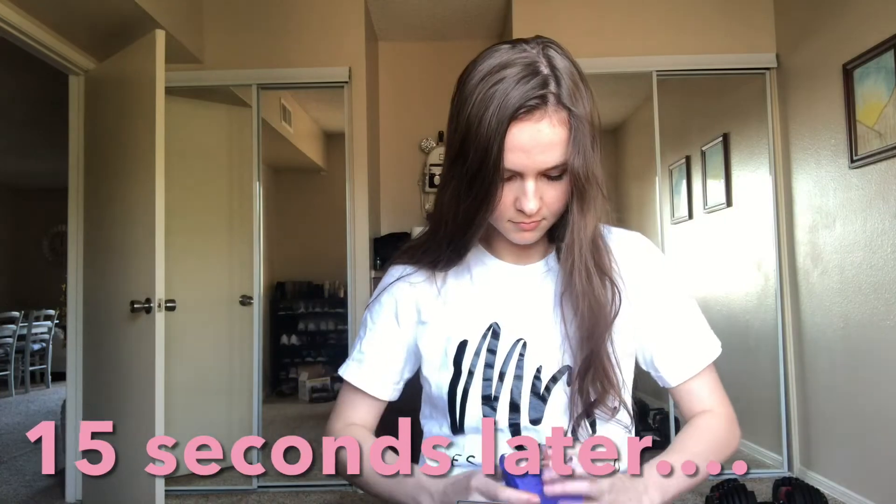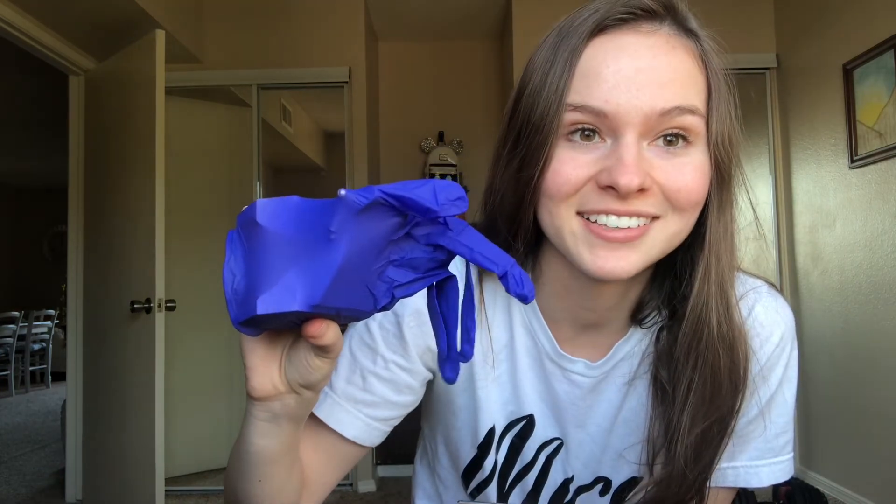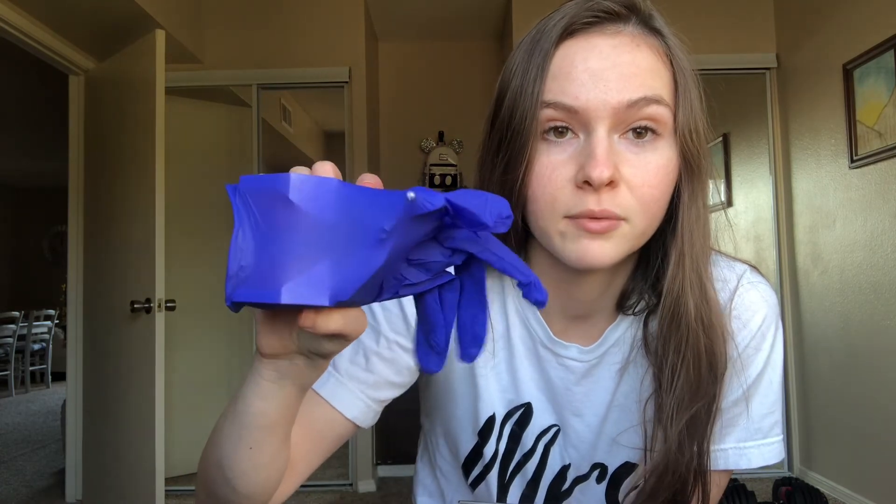One trick is to get a glove — you can actually make cheeks. Now my typodont has cheeks that I am able to retract with the mirror, and now I actually have to use the mirror and indirect vision in order to see teeth one, two, and three, which are now completely covered. This is a big tip for those that want to practice using the typodont at home so you can have realistic cheeks. You can buy cheek covers on Amazon for 20 bucks, but this glove was free.